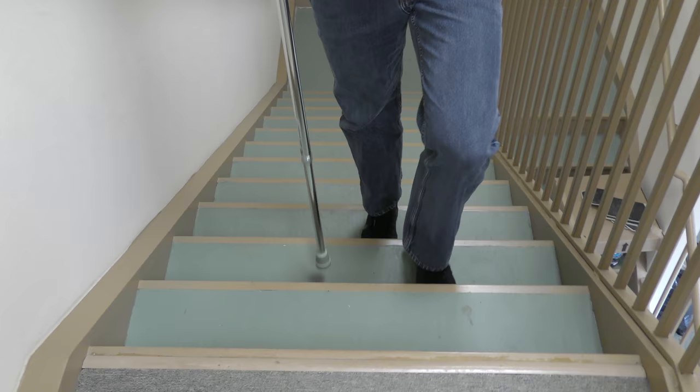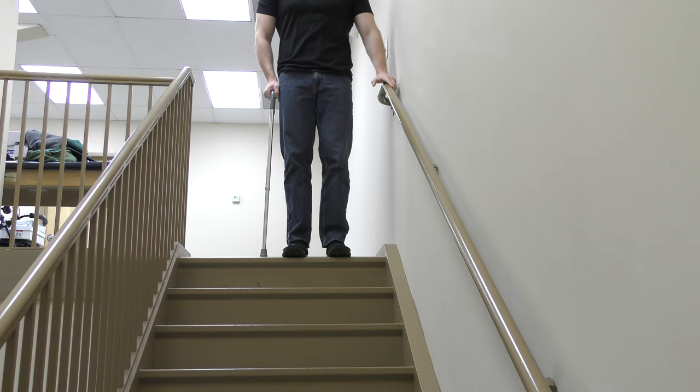Going up the steps reciprocally, simply keep the cane on the same step as the involved side. Remember, they always go together.